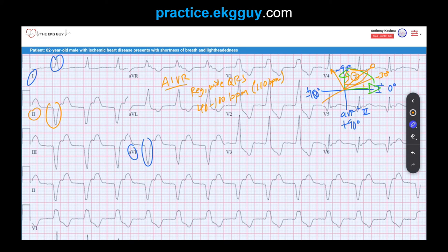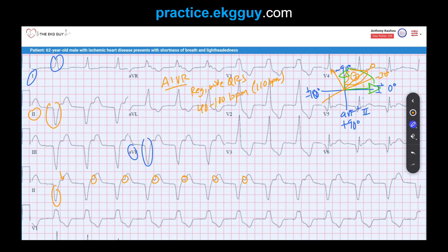One more thing to mention: ventricular-atrial (VA) activation can occur from this rhythm. Here you may be seeing atrial activity throughout, where the ventricles conduct retrograde to activate the atrium. That's probably what you're seeing from the notching in the ST-wave segment. That concludes this lecture — I hope you learned something.